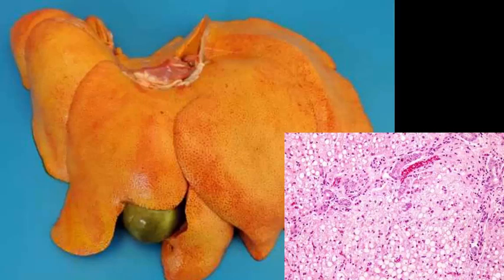Slide number 6. Oh, we got some histo in here. How'd that sneak in? But this is a great question, straight out of Jubb and Kennedy. So this is tissue from a dog. What is the most likely cause? A, Amanita toxicity.